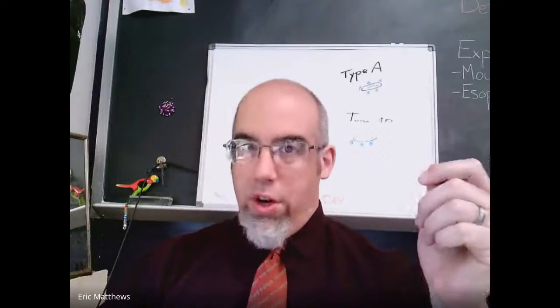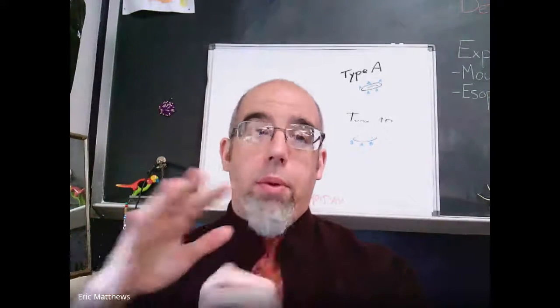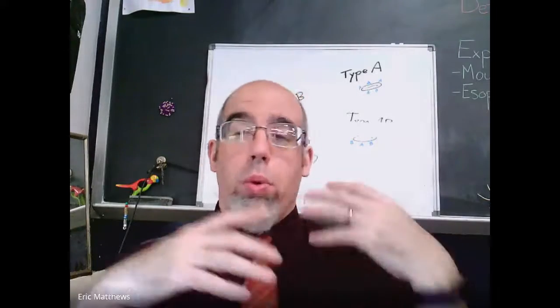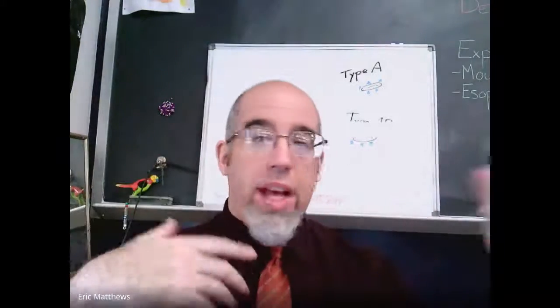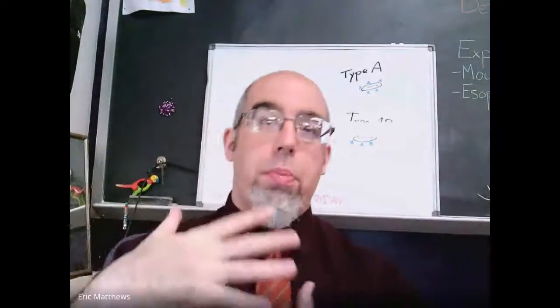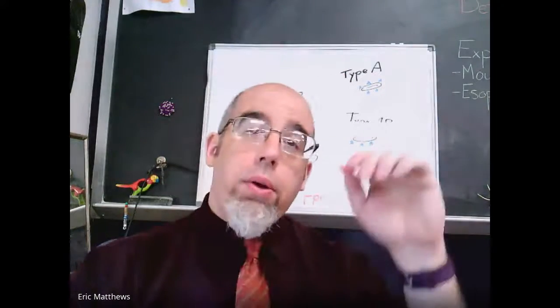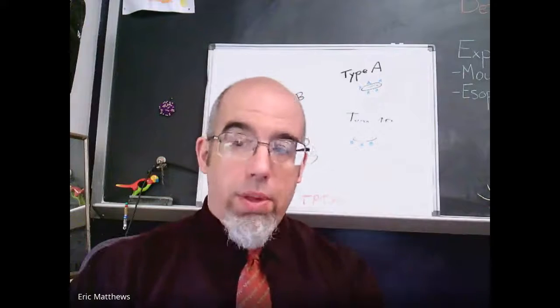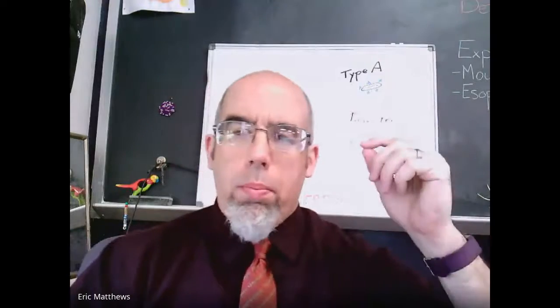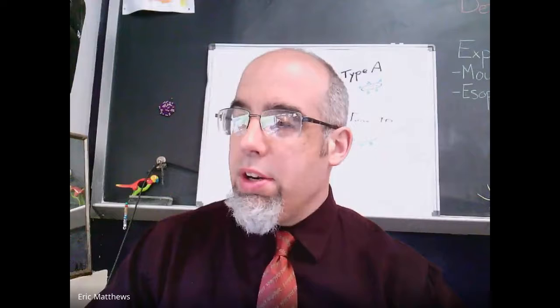It is the 3rd of May, almost into the last month of the school year. And today, what I wanted to go over is going to be our blood typing lab. We were talking about the circulatory system at the end of last week and the beginning of this week, about the heart pushing blood through your body, about the importance of the blood and what it can do. Today, we're going to go over how you test blood to determine something that we talked about way back in genetics, about what blood type an individual has. So let's get started with it.